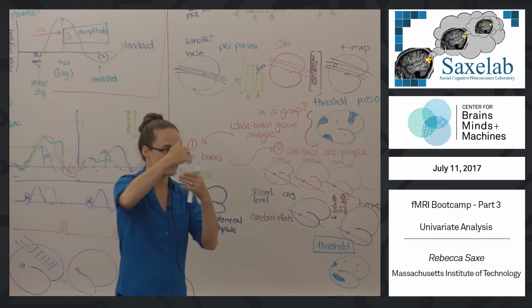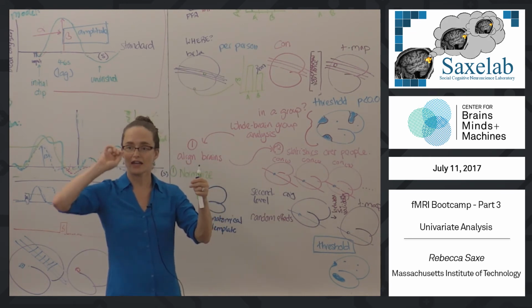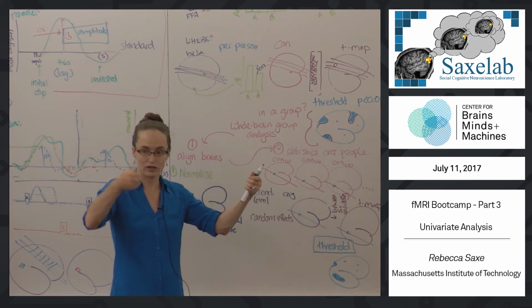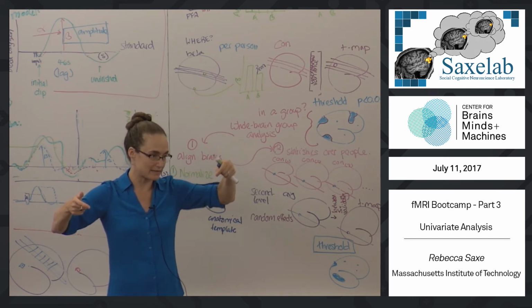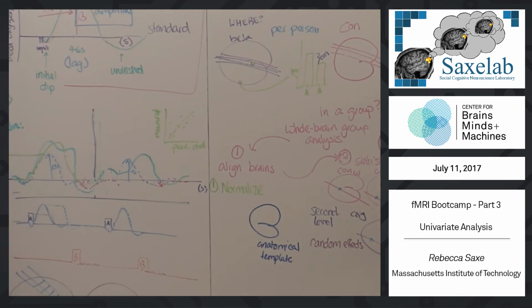So they sliced it in all the different directions, and they showed you what it looks like sliced this way or sliced this way. And you would literally have a big book, an atlas, and you would try to find the picture that looked most like the picture you were looking at. On the picture would be names, and so you would say, OK, if I see this shape, it's on page 92 that it looks most like that, and the label on that shape is the intraparietal sulcus, so I'm in the intraparietal sulcus. I actually remember doing analysis this way. That's how I did it. And the books are beautiful, too.